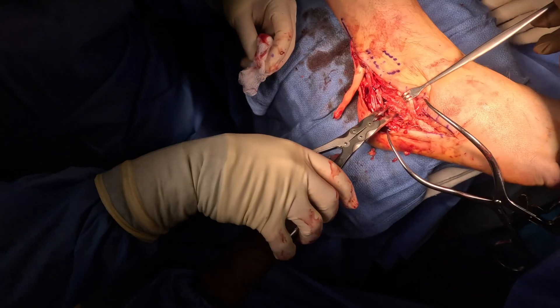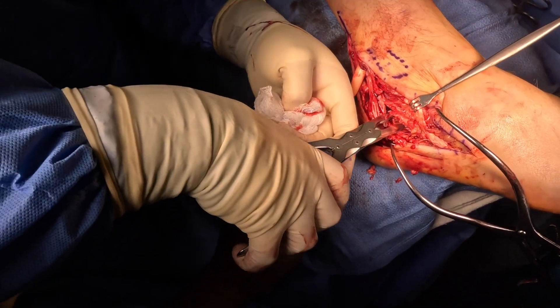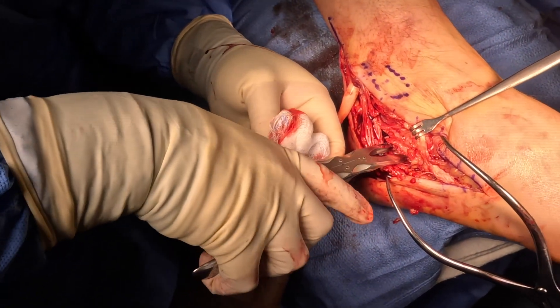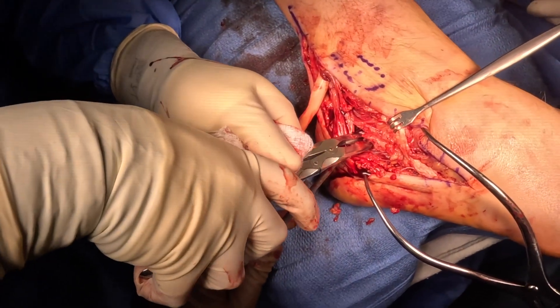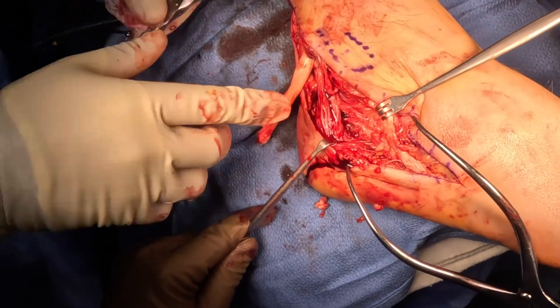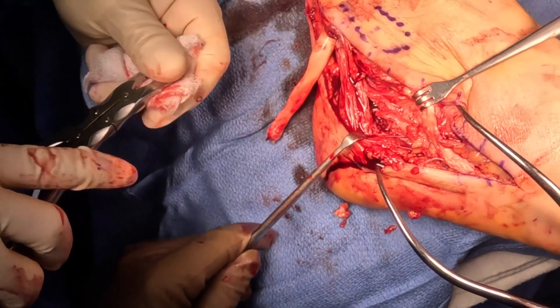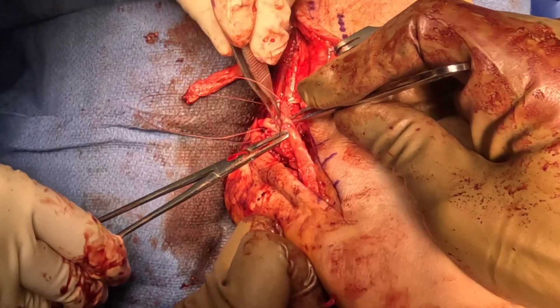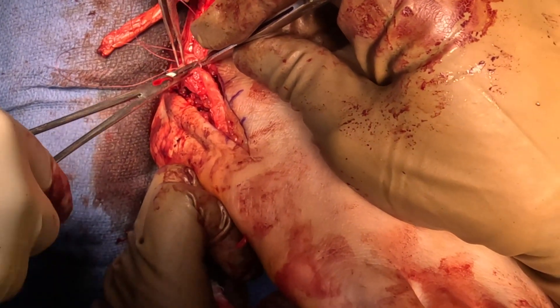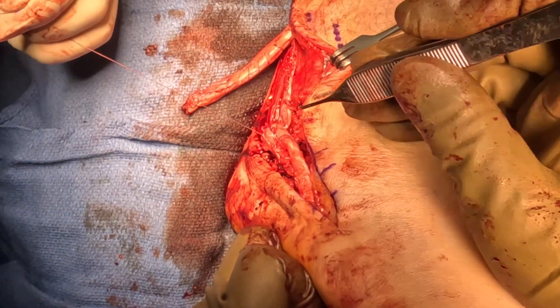The next step: dissecting deep within the area of the heel bone, there's a tubercle called the peroneal tubercle. Now this is an anecdotal claim, but usually in patients that have these ruptures, they'll have a sharp peroneal tubercle on the calcaneus or heel bone. You can see we're using rongeurs and removing that large bony prominence. Then we're going to do an end-to-end repair as best we can on the brevis tendon.